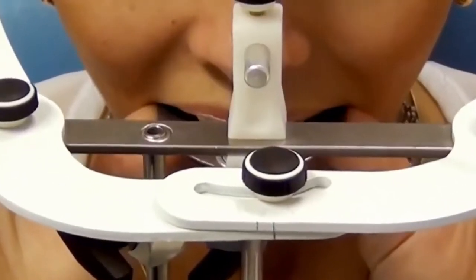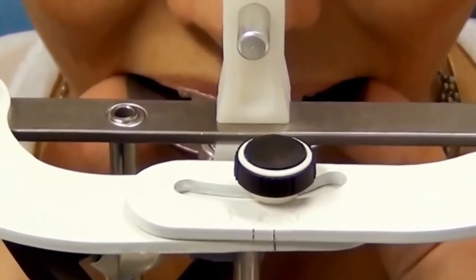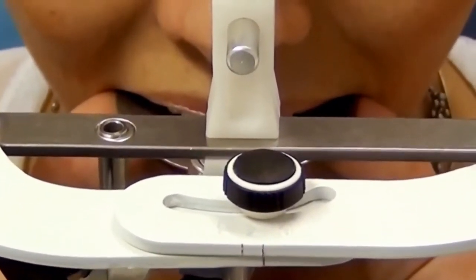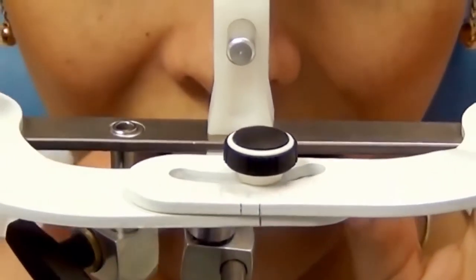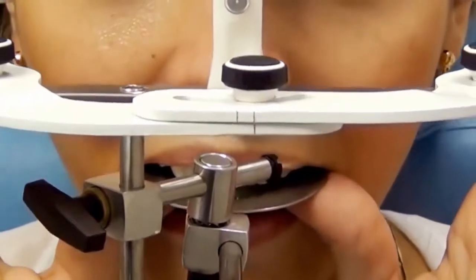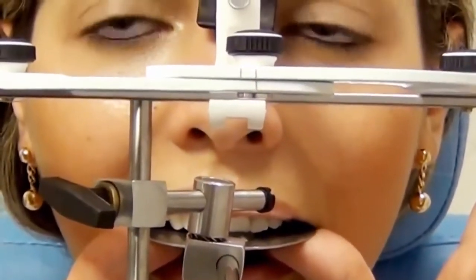For the 4000S articulator mounting, observe the measure of the intercondylar distance — one, two, or three — which correspond to the small, medium, and large intercondylar distances. For other models of articulator, the intercondylar distance is fixed at the average.